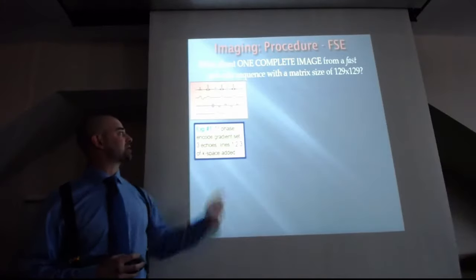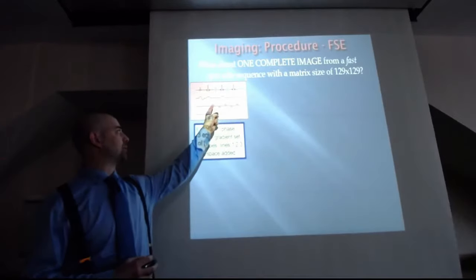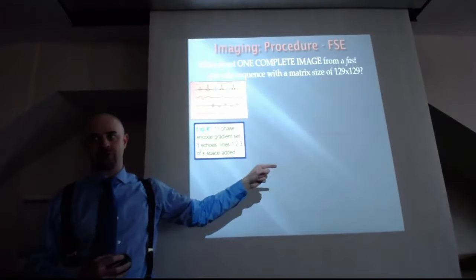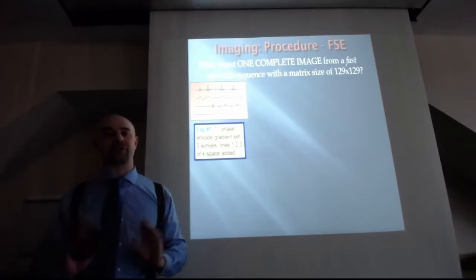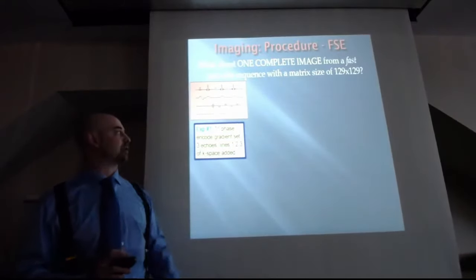All right, so now in experiment number 1, we have our first phase encode gradient set, right? So you have phase encode gradient 1, 2, and 3, each of which will give you 3 distinct echoes, which you can then place into k-space as your first, second, and third lines of k-space. Notice that you don't have to make that your first line of k-space, second, third. We'll talk about that in a second, how you can put them anywhere.